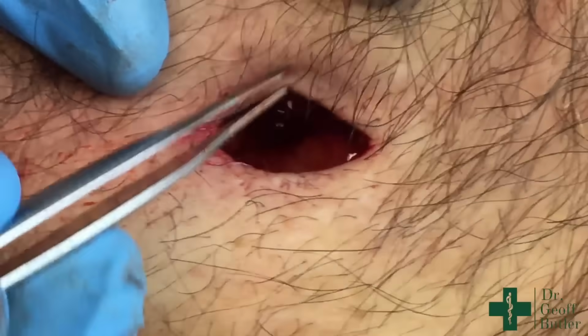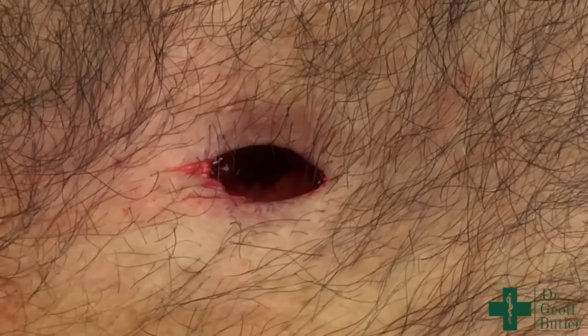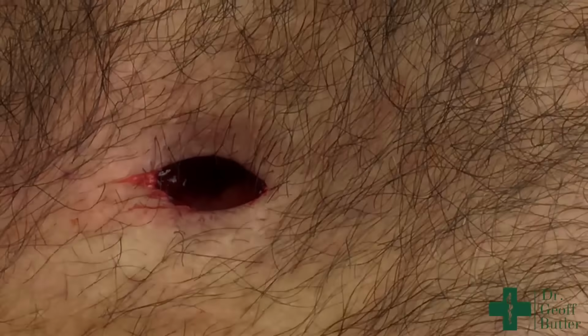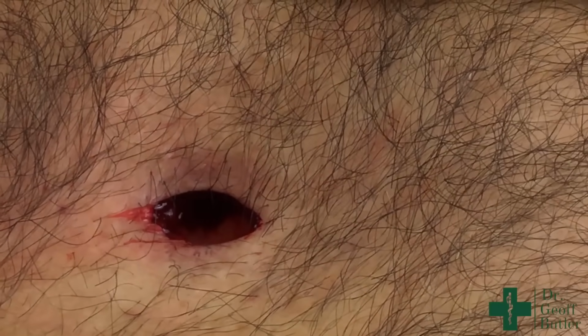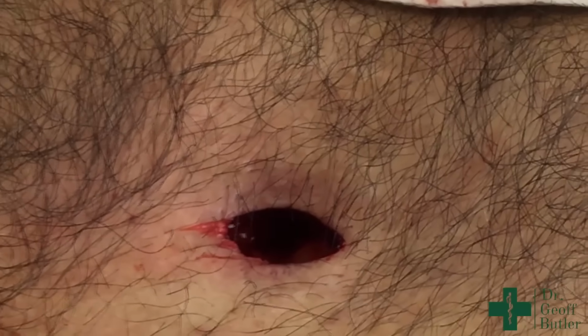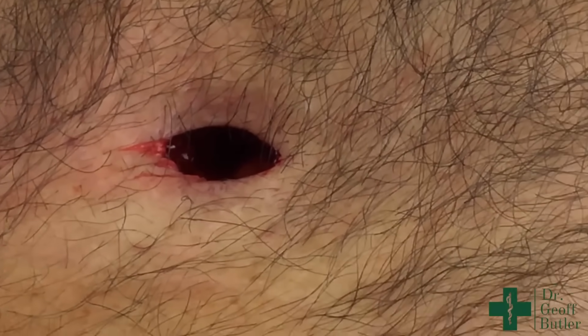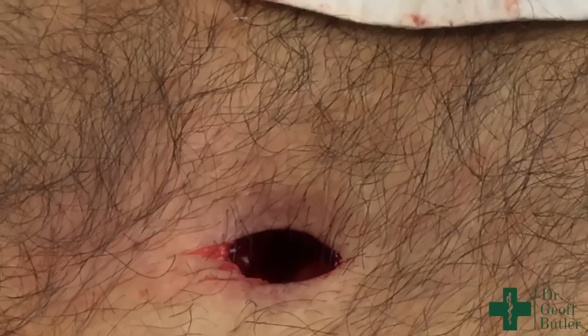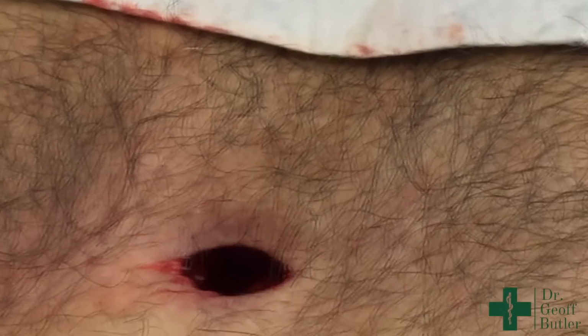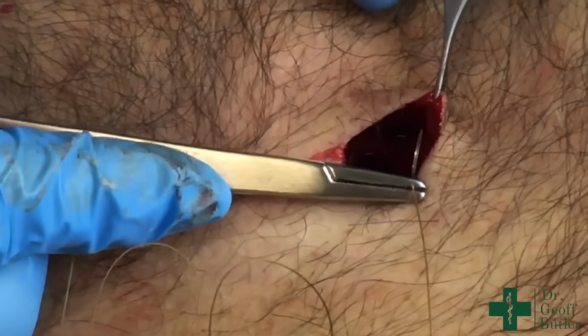So what we're going to do now is, even though we took out substantial mass, this is gaping more than we'd like. So we're going to put in some dermal sutures, and then we'll suture this up. The absorbable or dissolving sutures that we use are chromic gut. It's not the easiest suture material to work with. It grabs a lot, so it's not the most forgiving. So I always trim it just to make sure that it's a little bit easier to work with.